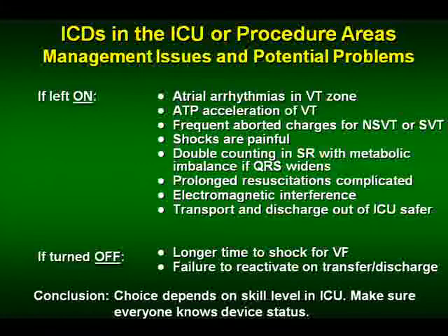One of the things that we'll see is people who are sick and have electrolyte imbalance. They have lots of short runs of non-sustained VT, and even though they never get a shock, the device charges. And I had one patient who came in, got charged 113 times in one night, never got a shock. No one ever appreciated it. He had a 3-week-old defibrillator that had to be replaced because he was sick with sepsis.